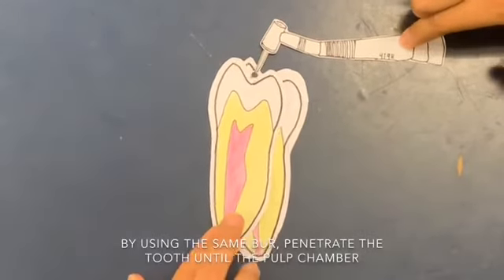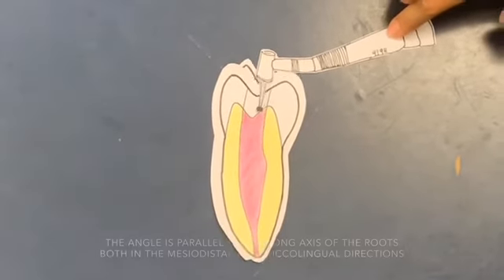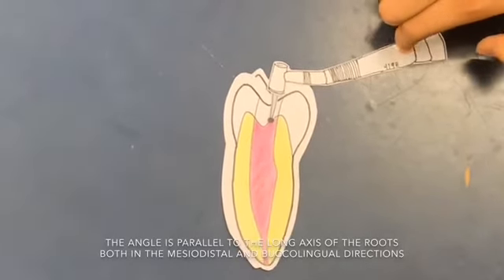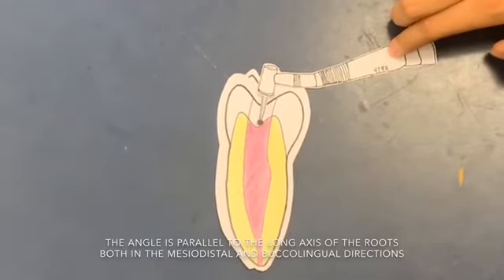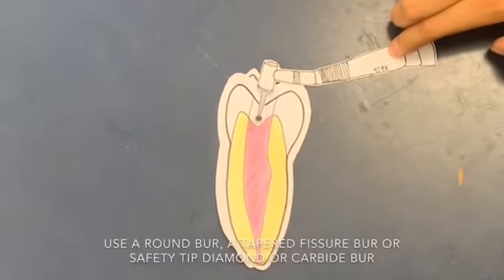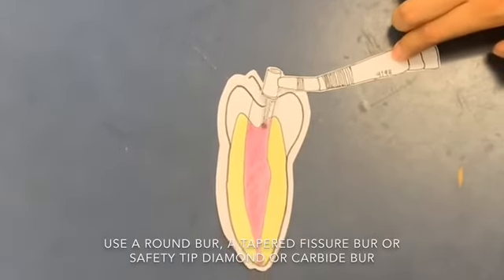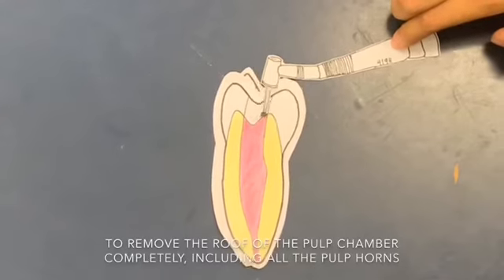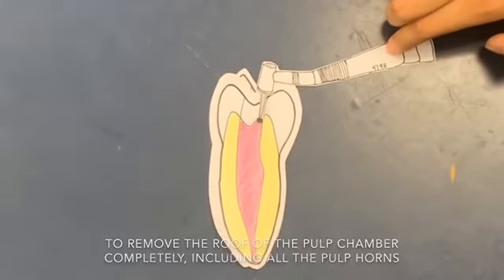Using the same burr, penetrate the tooth until the pulp chamber. The angle is parallel to the long axis of the roots, both in the mesiodistal and the buccolingual directions. Use a round burr, a tapered fissure burr, or safety tip diamond or carbide burr to remove the roof of the pulp chamber completely, including all the pulp horns.